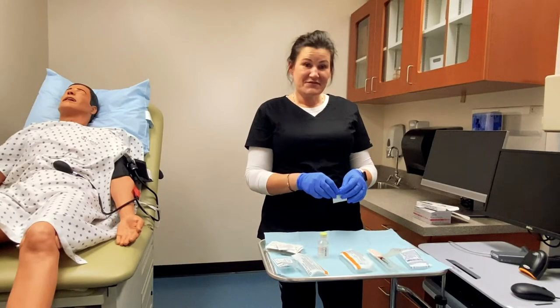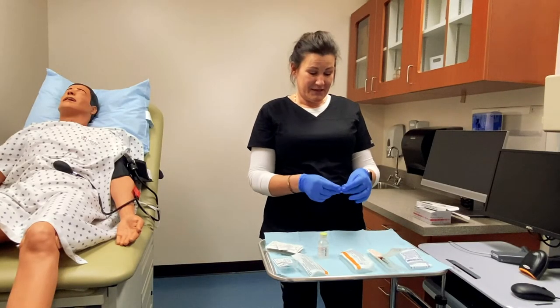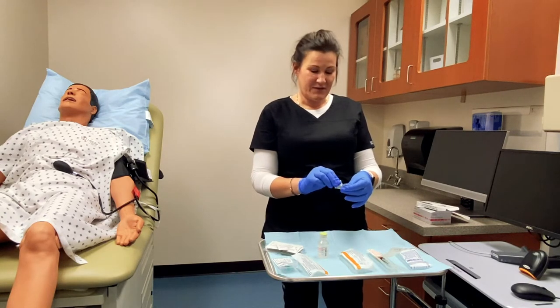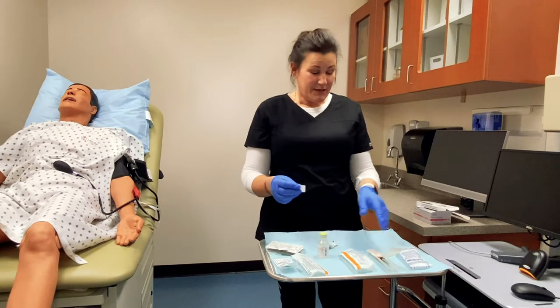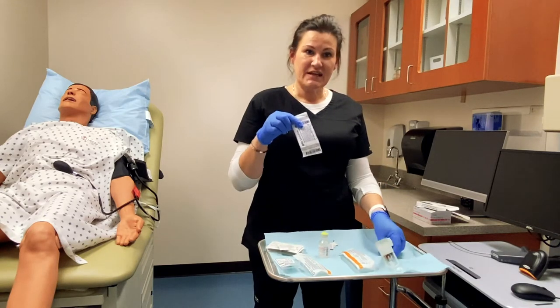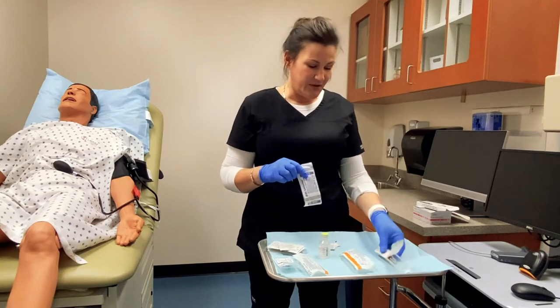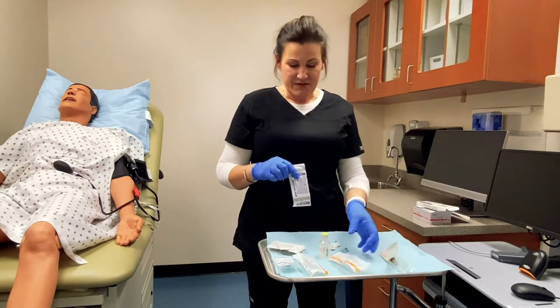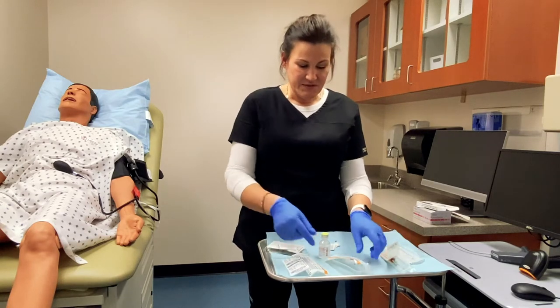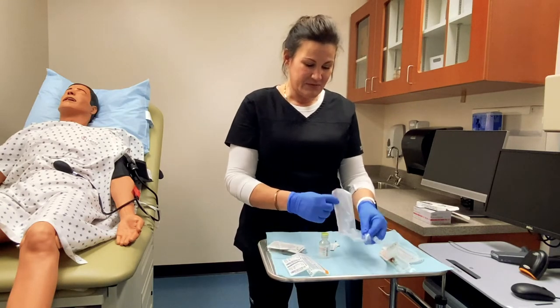Hey everyone, this is the first video we have recorded in a semester and a half, so I'm not guaranteeing we're going to get through this without giggling. But today we are going to learn about insulin needles, TB needles, subcutaneous needles, and our IM needles and how to select which one of these is most appropriate.